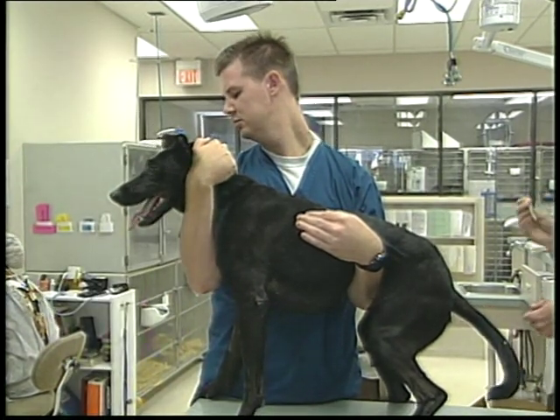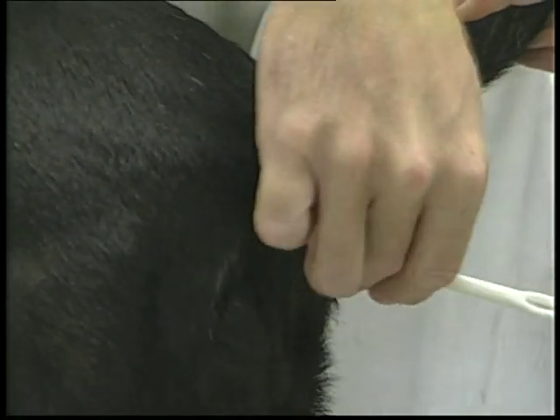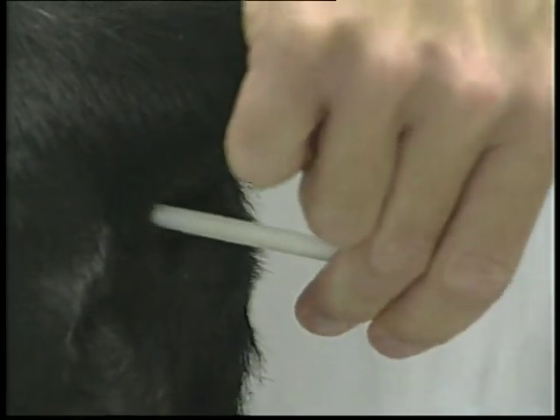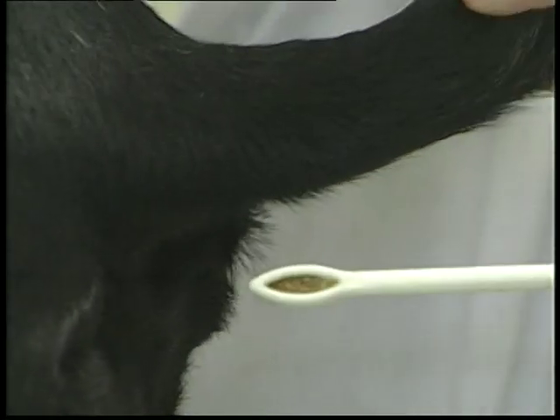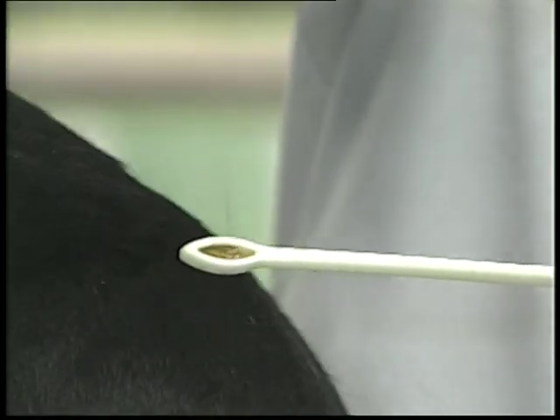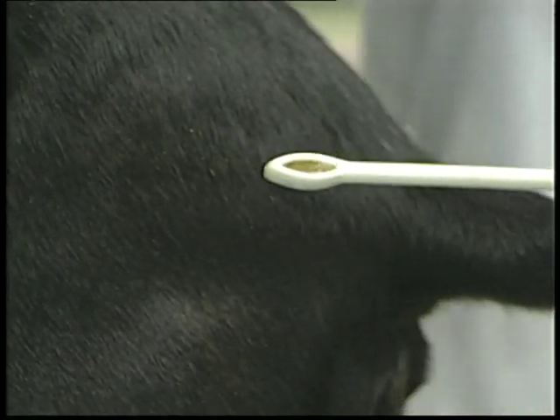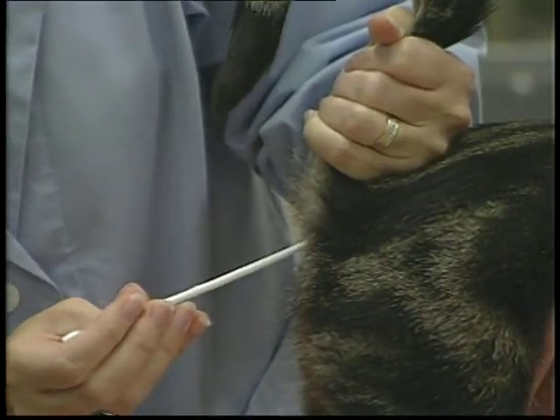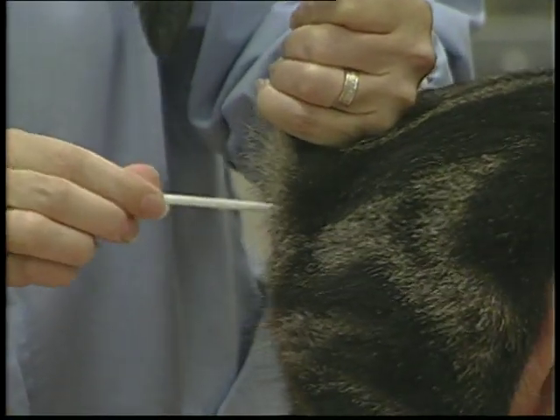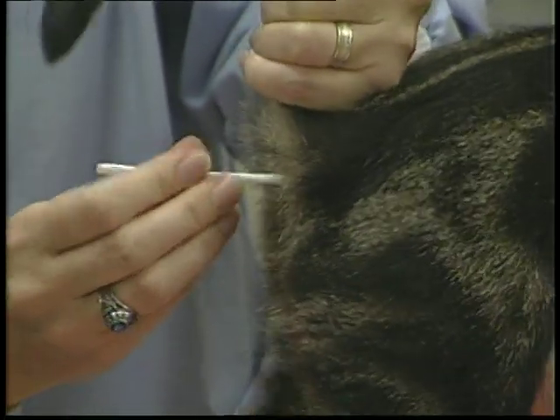When passing the loop into the large colon, you will likely feel the slight resistance of the stool. When the tip of the loop is likely embedded in feces, give the loop several twists and remove. If the stool is not present, you may attempt this procedure again slightly deeper if the pet was not uncomfortable. A smaller fecal loop is available for obtaining samples from cats and small dogs. We are now ready to proceed to the next step.